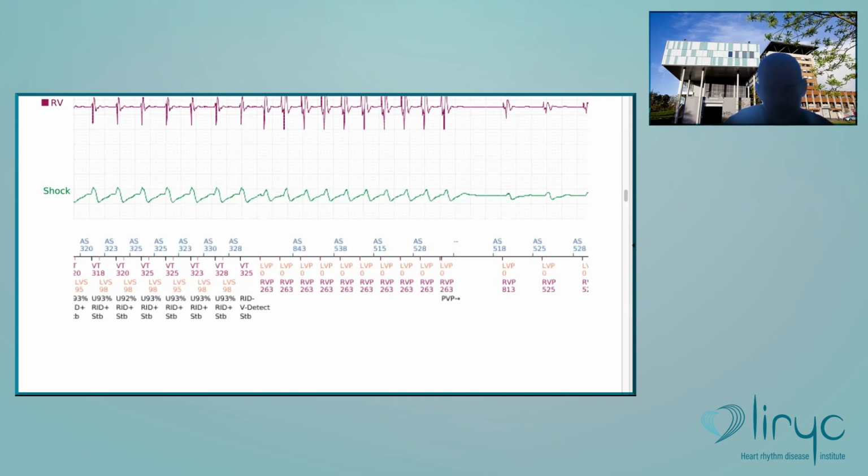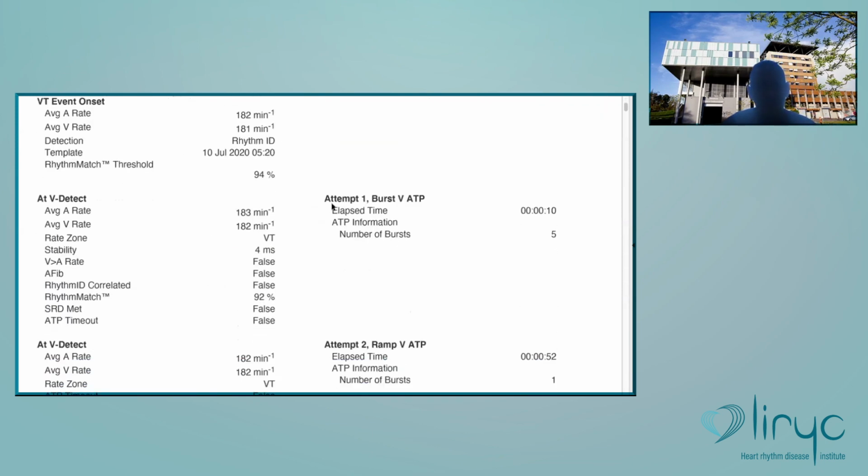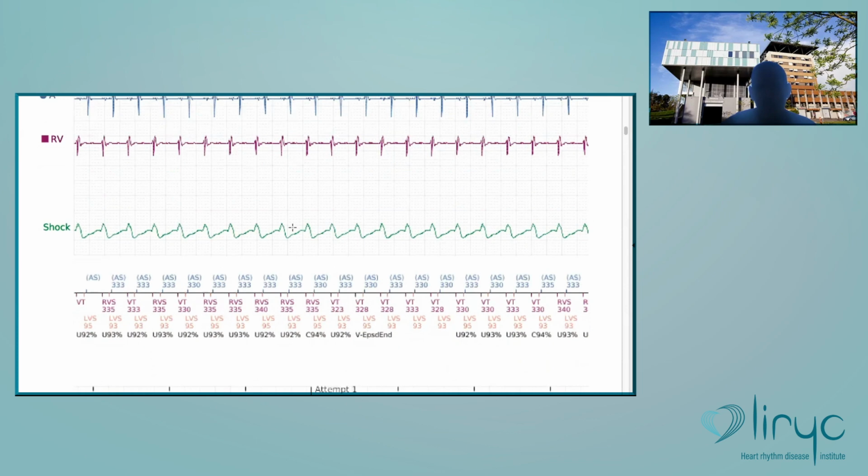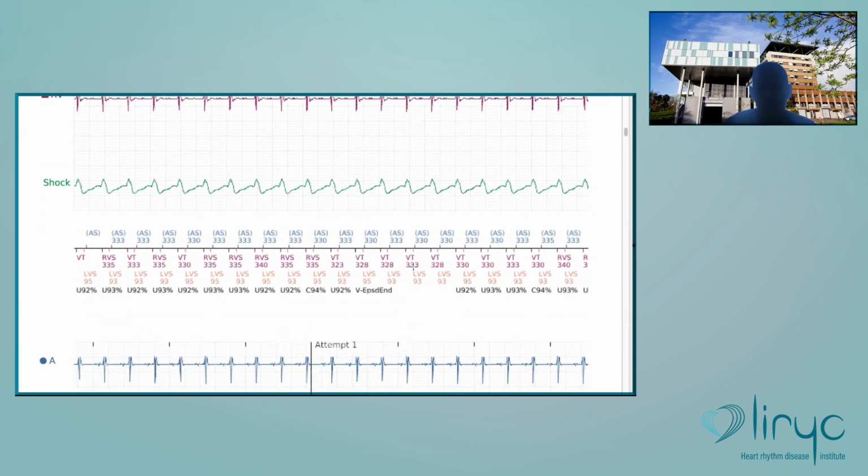Okay, the same patient here, you see this is the same patient, and you see here it's a one-on-one tachycardia, exactly the same. You see the percentage.